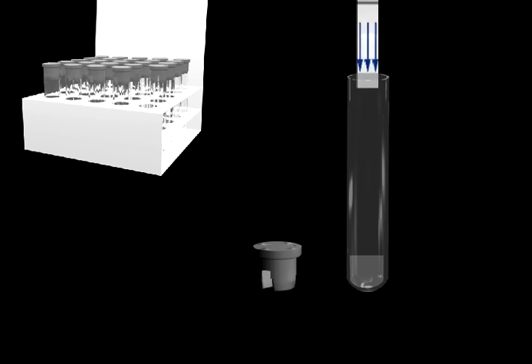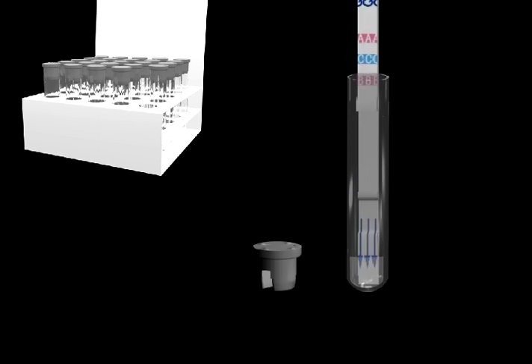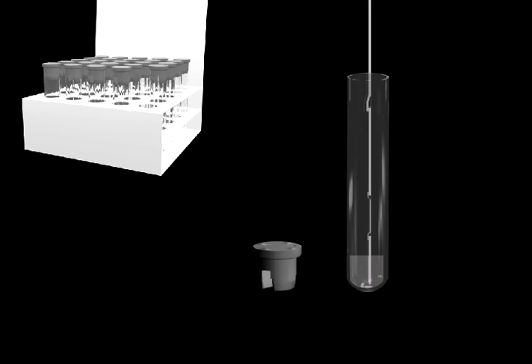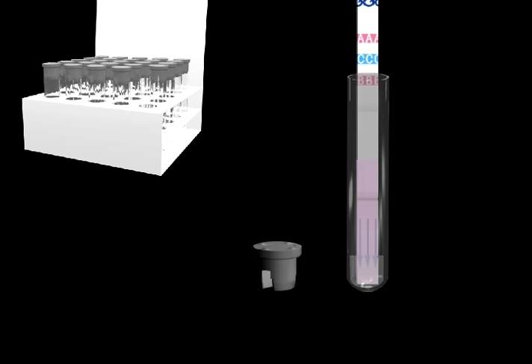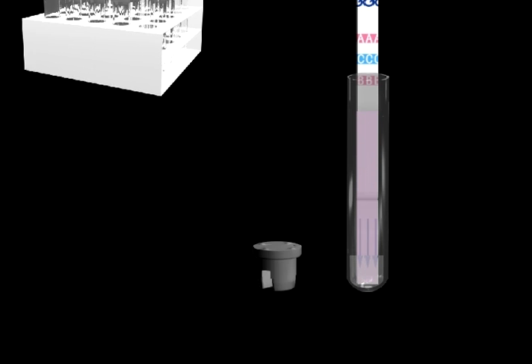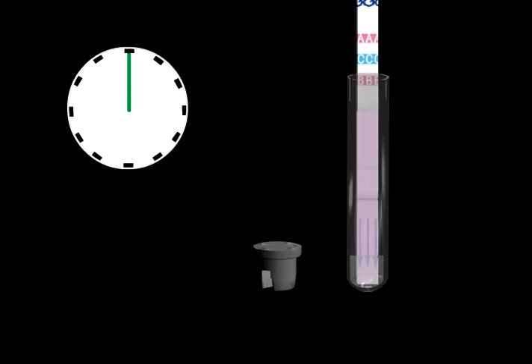A test strip is added to the tube where it absorbs the sample. Results appear in 10 minutes or less.